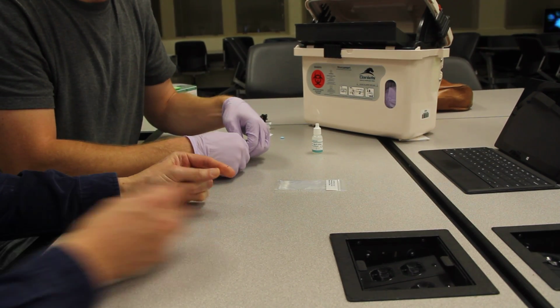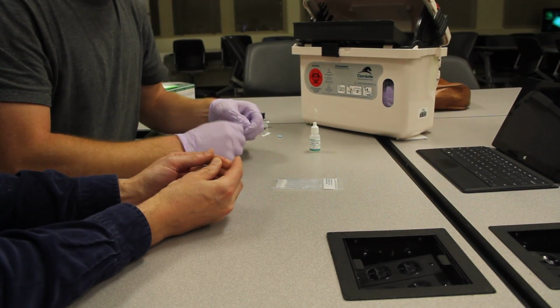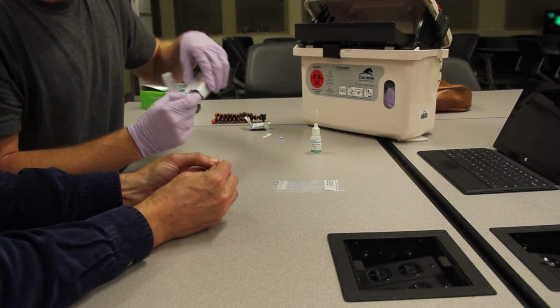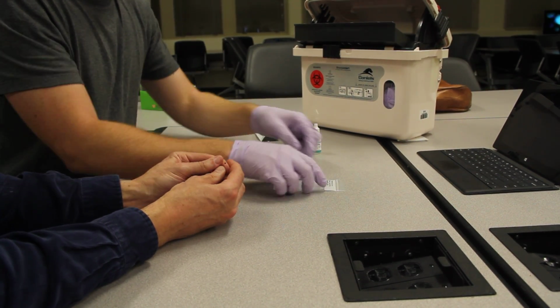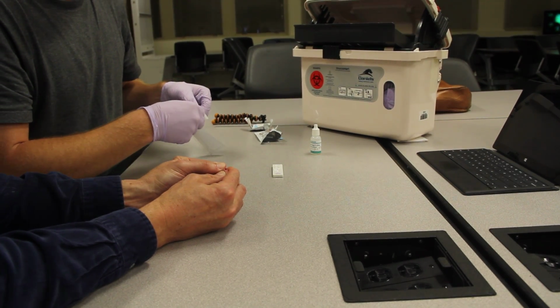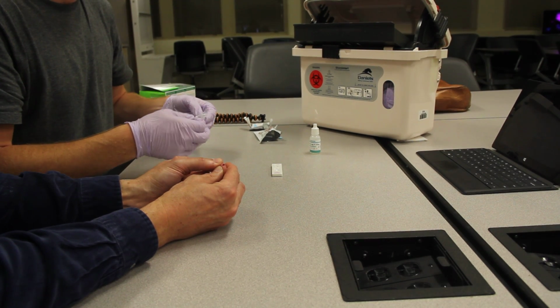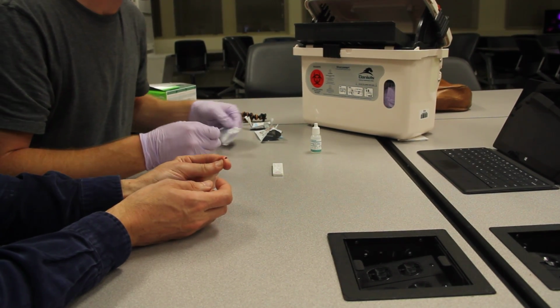So now while I've got that sitting there, I'm going to get my cassette out and ready. Set that here and get my blood transfer device out. And while I'm doing that, you can see he's got himself a nice big drop of blood going. That's very helpful for me.